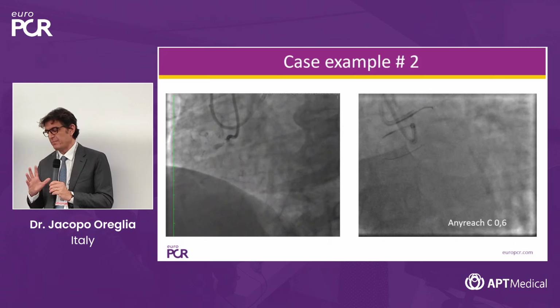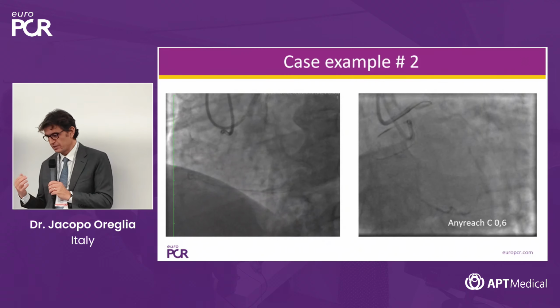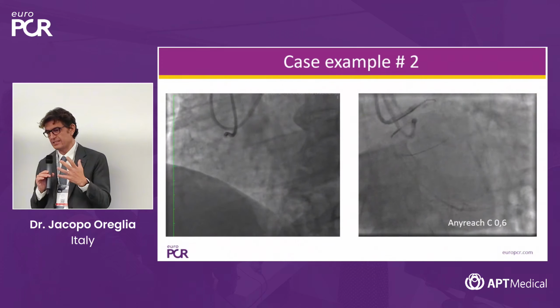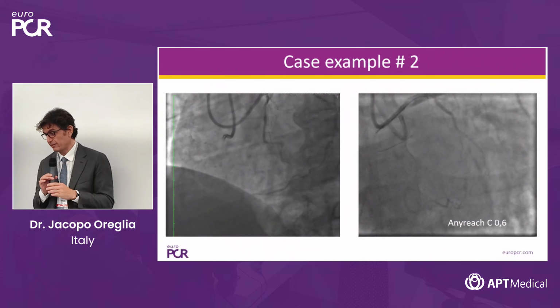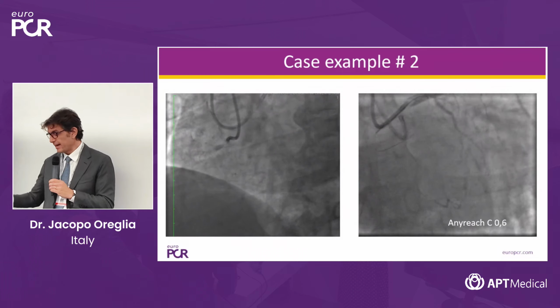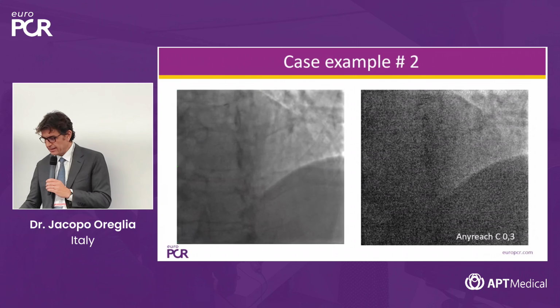We also have epicardial collateral. So we were supposed to focus on the septals, but just to show that also the epicardial collaterals can be crossed easily, but you have to select them very carefully. And again, you use your microcatheter, you use your routine guide wire in order to select your epicardial collateral. And then what you have to do is the same thing.